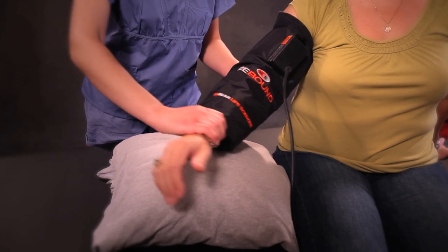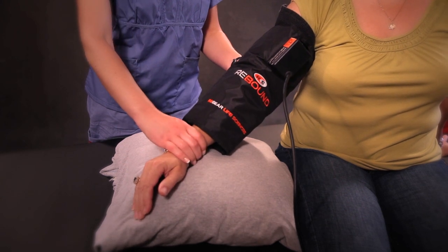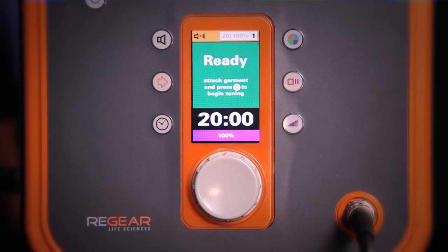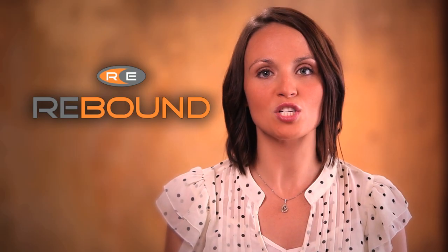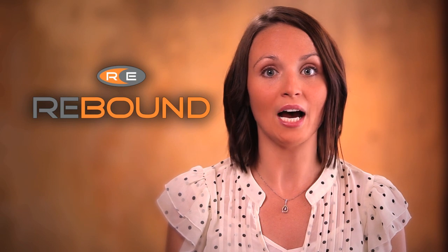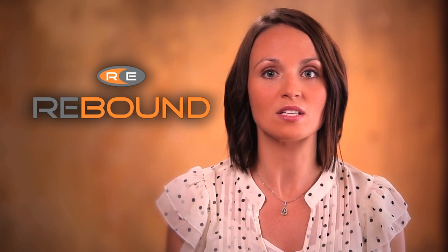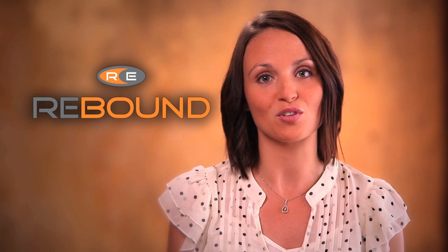Once the therapy garment is attached to the Regenerator and on the patient, get them into a position that they will be in for the remainder of the treatment. Make sure they are comfortable, then press the continue button to begin tuning. Tuning makes sure the Regenerator is communicating with your patient. It looks at the resistance created by soft tissue — including blood, muscle, hydration, and fat — and uses that information to customize the therapy so it will penetrate the superficial layers and reach deep into the tissue.